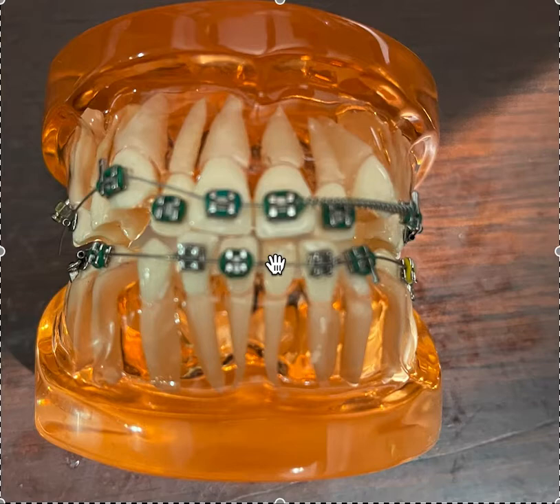They're pretty similar prescriptions. Again, watch my other video on the difference between those, but you need to stick with one vendor. There are just subtle differences between certain orthodontists, like, I like this much torque on a lateral, or I like this much tip on my molar. You will not notice any difference, and your patient will not notice any difference. Try to keep it consistent, because if you have one lateral that's one type and one lateral that's another, they're not going to be symmetrical, which is why you need to keep your patients symmetrical.